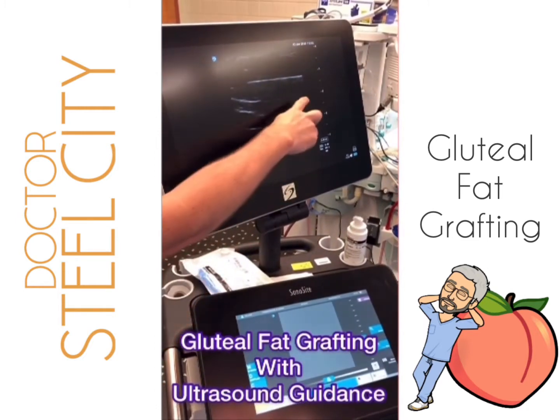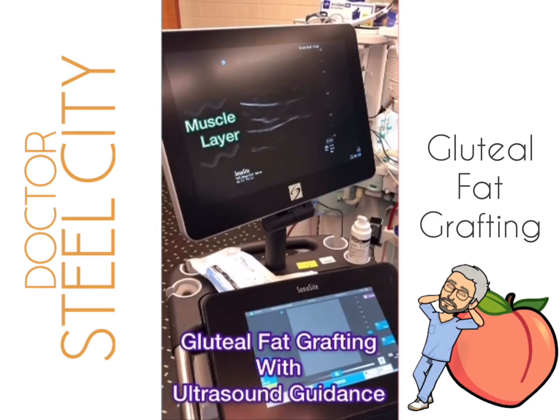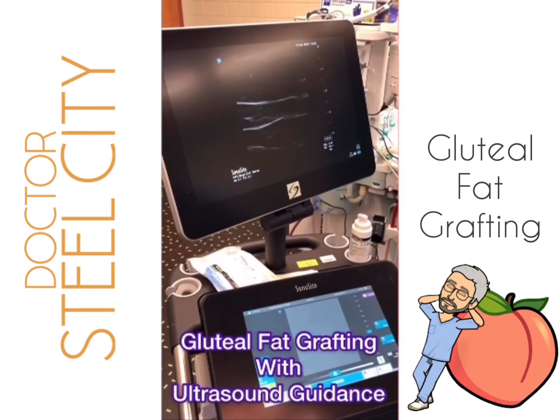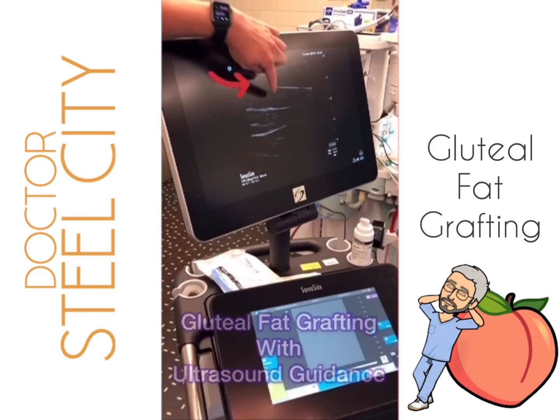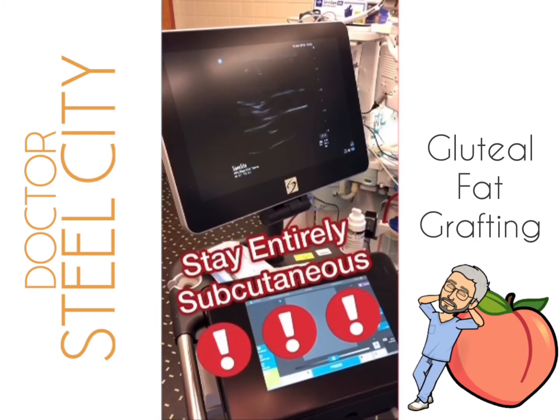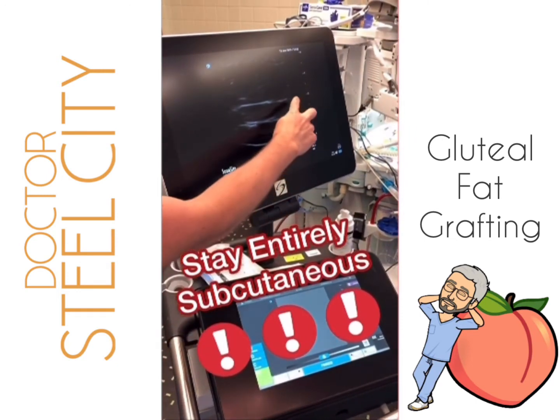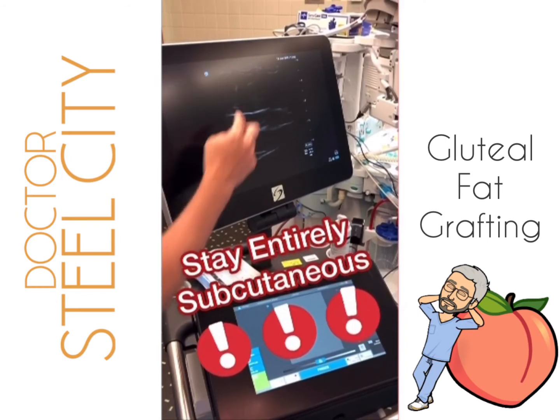That's the muscle layer showing the fascia. I can feel that muscle layer with my cannula, so we're going to have to stay in this subcutaneous space right there as we fat graft — for ultimate patient safety, to stay entirely subcutaneous. Showing that fascia line again, we have to stay between that fascia and the top to remain totally subcutaneous.